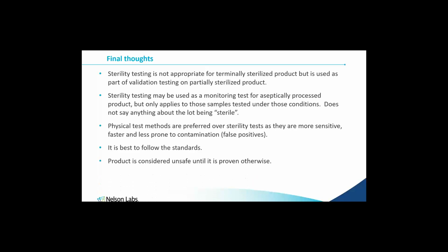All right, and here's a fun one. Product is considered unsafe until it's proven otherwise. So when you do have a false positive, now you've got to prove that was a contaminant and not a failure of your entire sterilization process.